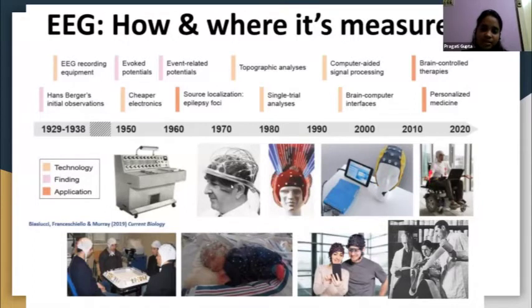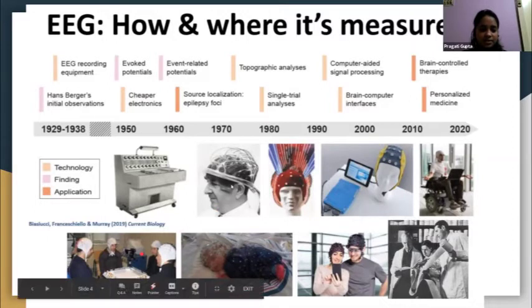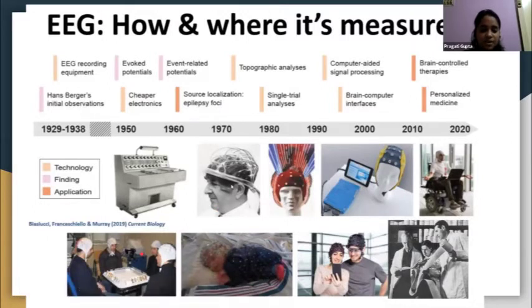Now in late 2019 or 2020, we are seeing the BCI, brain computer interface, where we don't use the amplifiers and all, which means we're using both EEG and ERP as a technique here. And down here we are seeing, for example, that from four of the participants we are recording the electrical signals at the same time. This is known as hyperscanning.